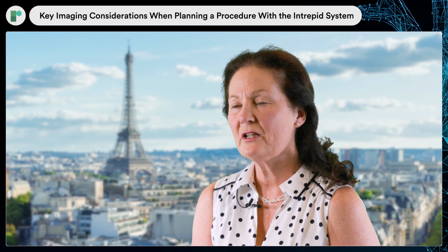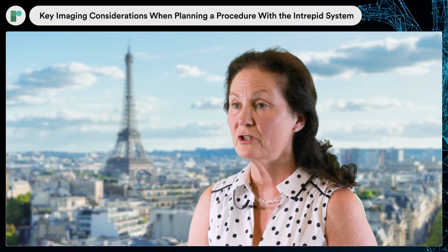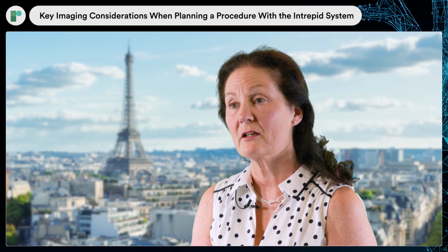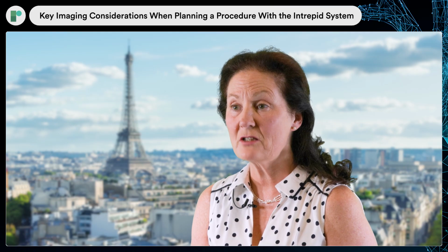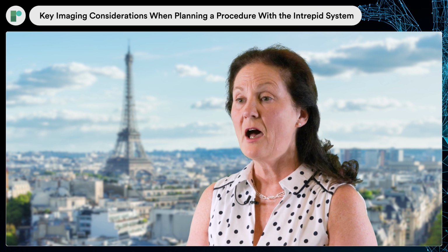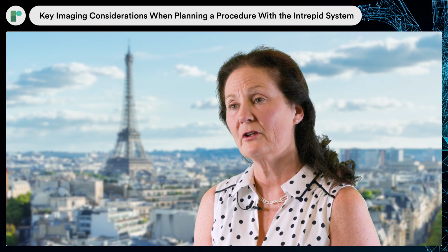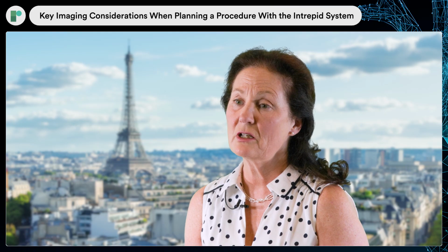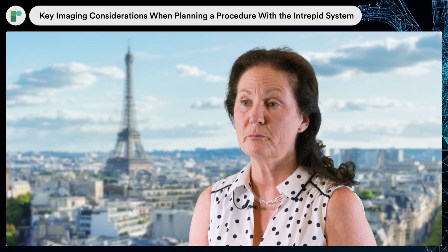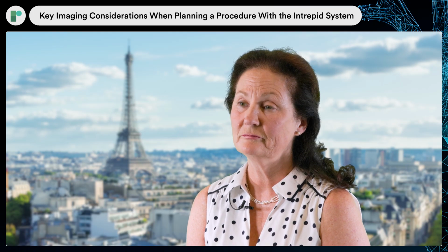For imaging the mitral valve itself, we would think about using multimodality imaging. So echocardiography, transthoracic and TOE, and CT scan, with a view to figuring out three things: the mitral valve anatomy, and the annular size itself, to make sure that we've got a valve that's big enough to fit in the annulus, and that when we put that valve in, it's not going to obstruct the left ventricle or the left ventricular outflow tract. So all of the pre-procedural imaging will help us to come to that decision, but the two main imaging modalities will be transesophageal echocardiography and multi-slice CT imaging.